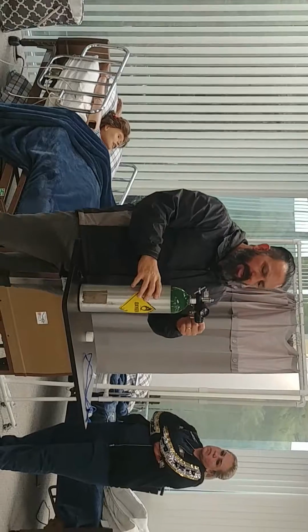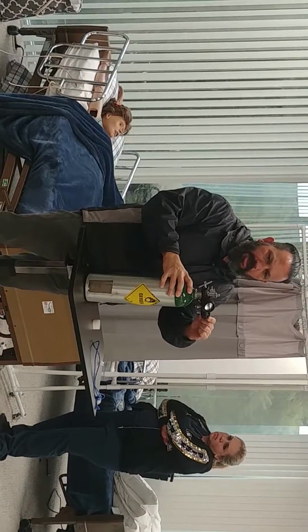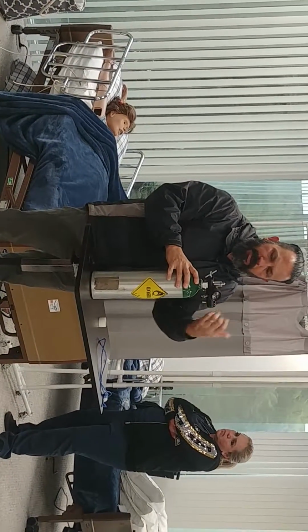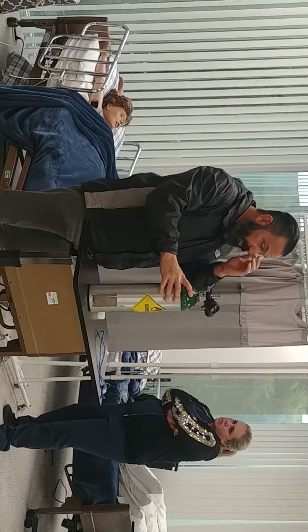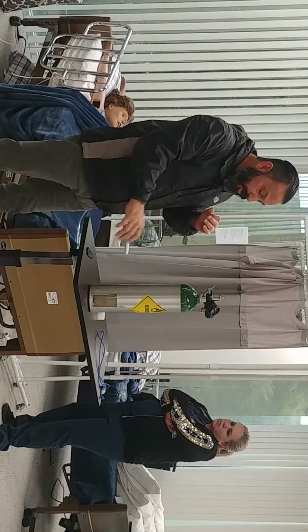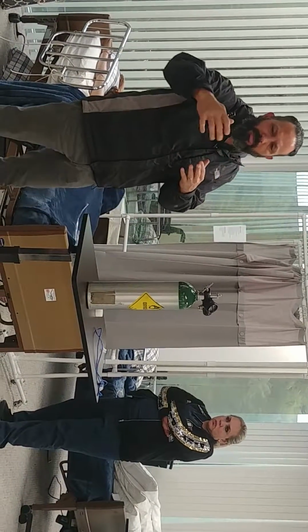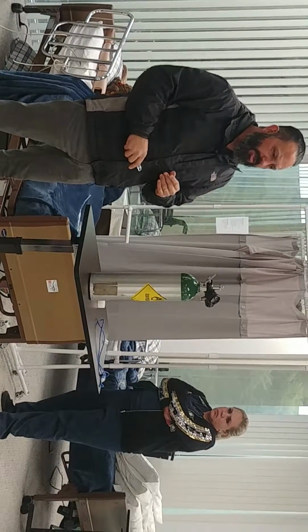Now when we come here to the selection gauge to select 1, 2, 3, 4, 5 liters per minute, then we start to flow. So when we come up to a cylinder, the first thing that we need to make sure we do in the midst of swapping it out is closing the bottle. We're closing the source.